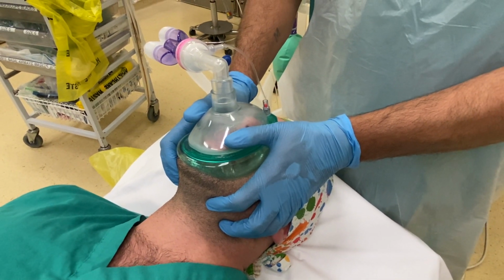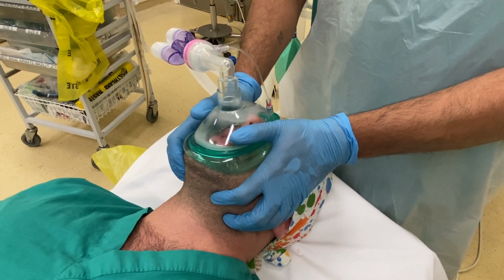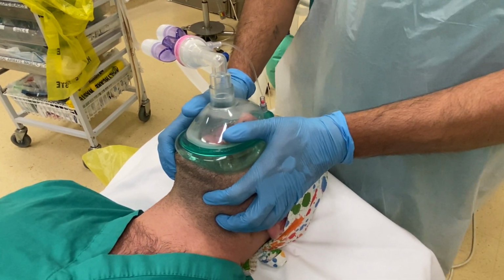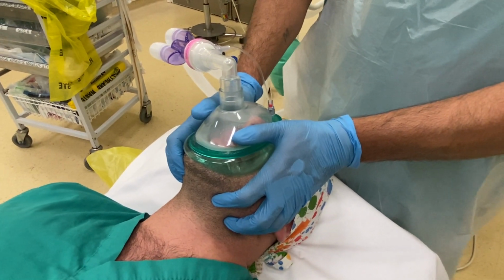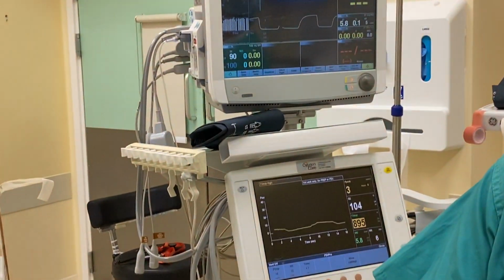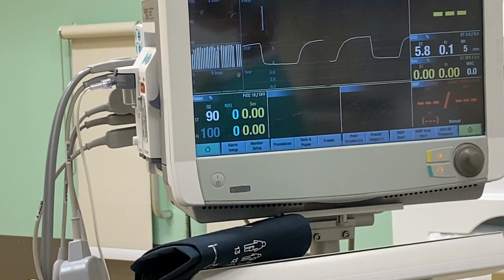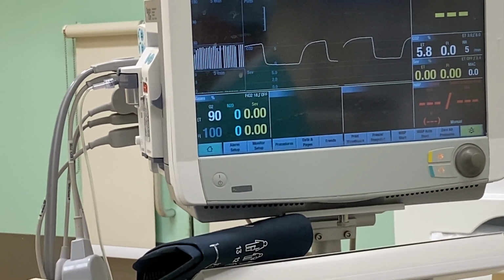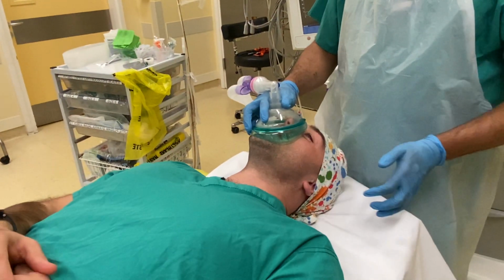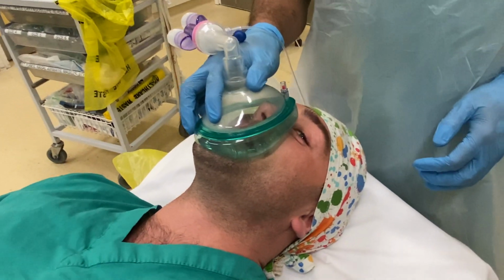It doesn't particularly matter how you hold it, as long as you're getting a seal, getting the oxygen into the patient, and that you're not distressing them when they're awake before they've had their anaesthetic. And now we can see, as Kumar has been pre-oxygenating Irla, his end tidal O2 is 90%. Very happy to anaesthetise Irla now. He's ready to go. He'd be apneic for 7 minutes easily there, no problem, nice and pink. And that's how we hold a face mask.